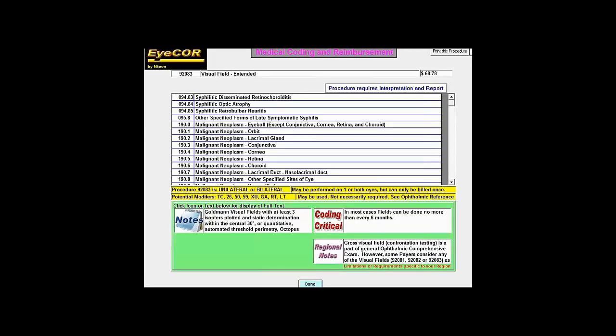One of the things that Chris was talking about was on visual field. What we're really looking at is not just using it when you have a diagnosis. Chris did mention screening. What we really emphasize is also use this device and your other devices too in a screening mode. If you have suspicions, we realize that you cannot bill a certain procedure if you only think something's going on or if you're looking for something. However, a number of times, and Chris had a number of examples about the different things that you can find when you are looking, using your instrumentation accordingly.